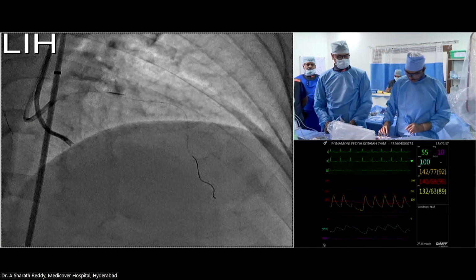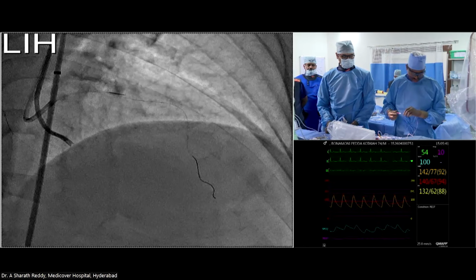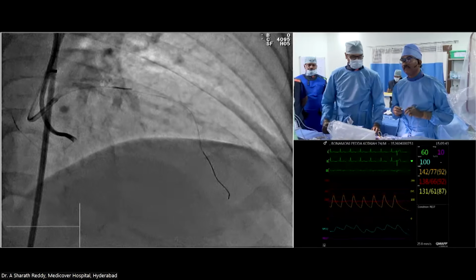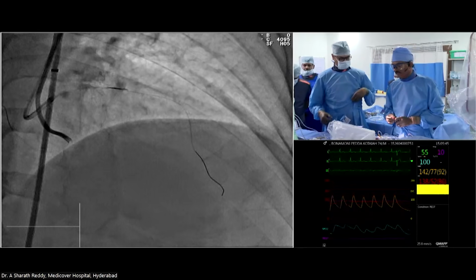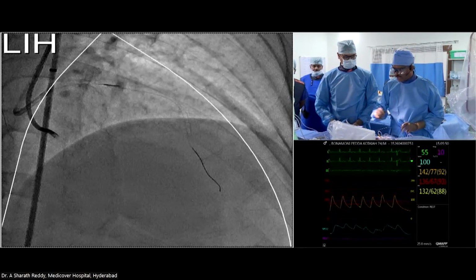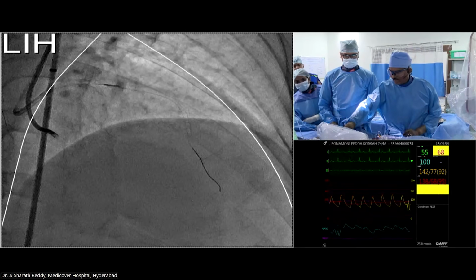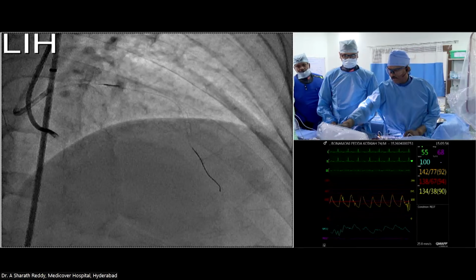Sharath, we'll pause you a bit. We'll have a discussion here on the stage. Yes, please go ahead. Maybe for the discussion, show us the first simultaneous shot, because sometimes the artery looks different from the single diagnostic shots. Yes, I hope you did one. Yes.